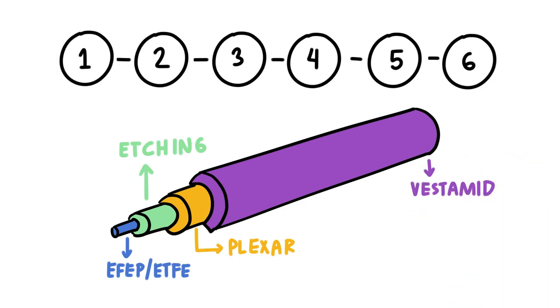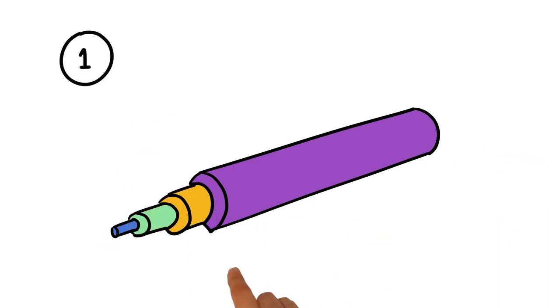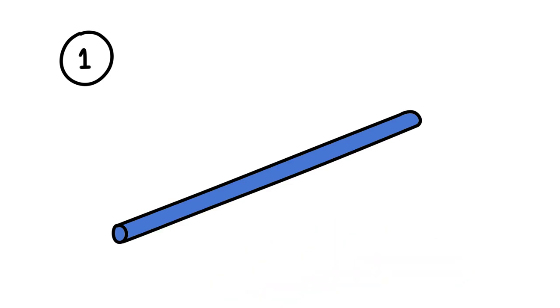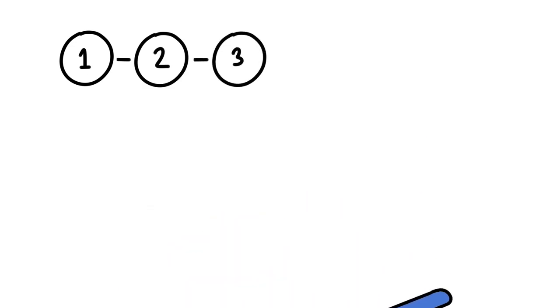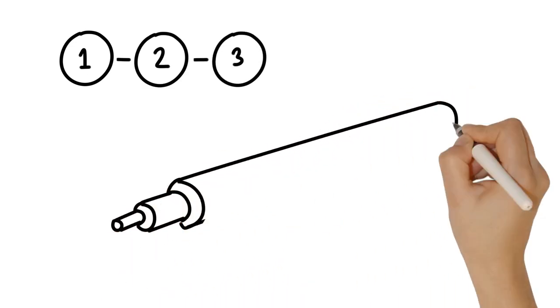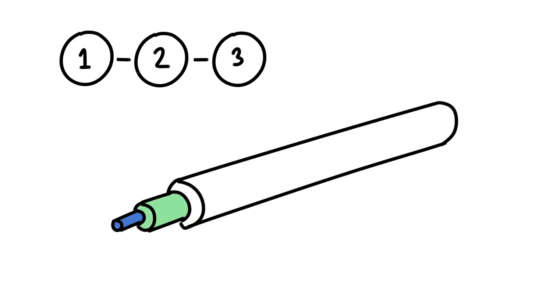First, the extruder creates the smooth FEP or ETFE fluoropolymer lining. Second and third, the outer surface is either etched or applied with an adhesive layer of Plexar, depending on fluoropolymer types.